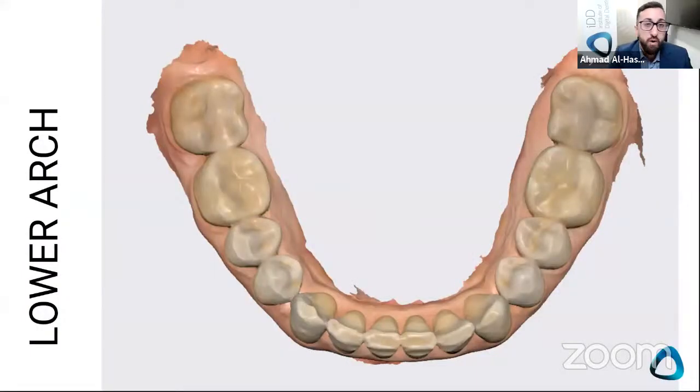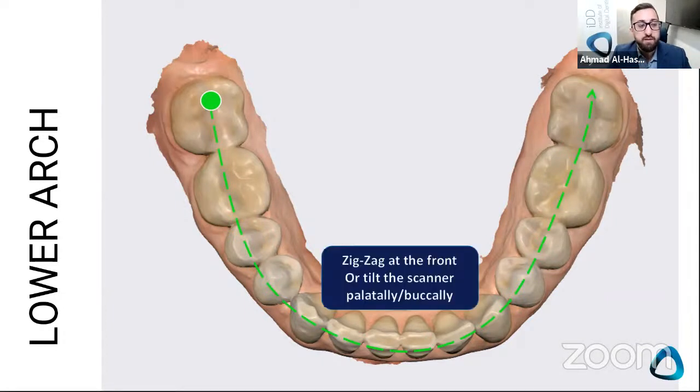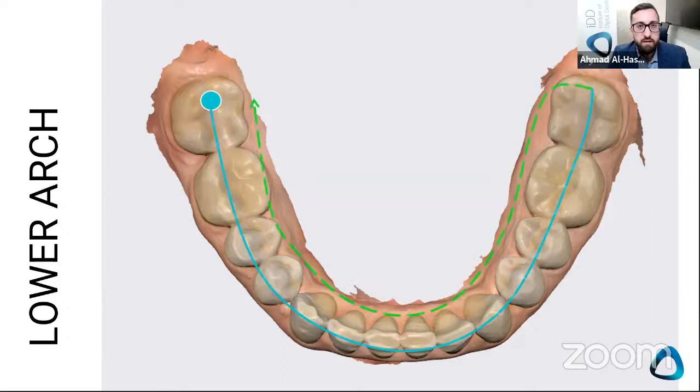If we move on to the lower, it's the exact same protocol. You're going to start on the occlusal. You're going to go across to the other side, zigzag or tilt palatally or buccally in the anteriors. And that's again because it's such a thin surface, you want more data for your scanner so you can continue so it doesn't get lost. You're going to rotate to the lingual and go all the way to basically where you started.